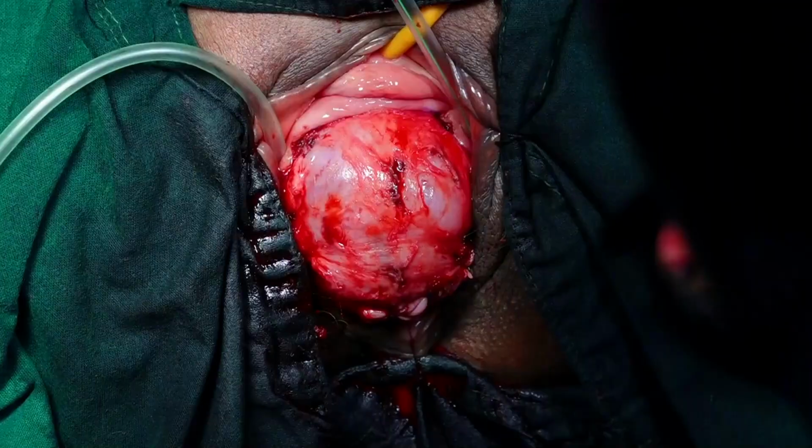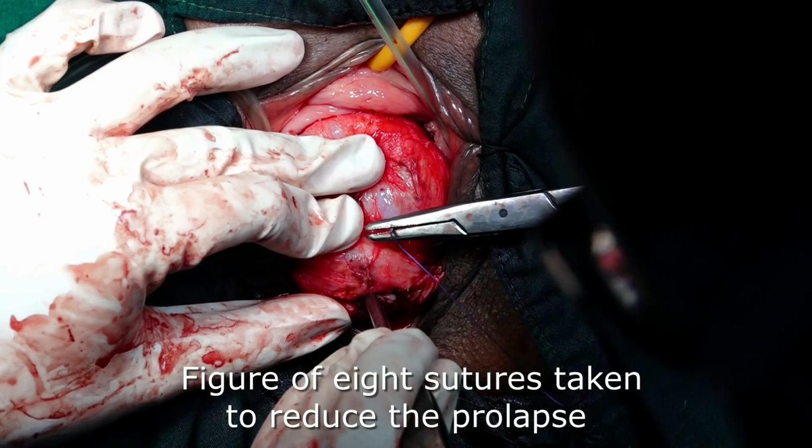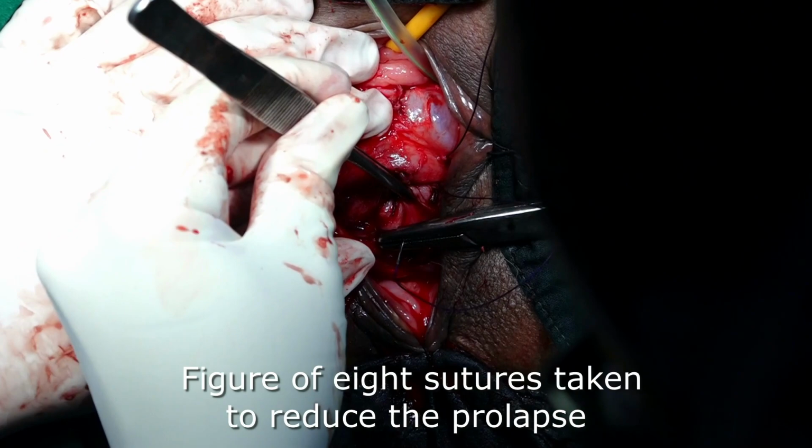With the tunnel created on both sides, the surgery proceeds to reduce the prolapse with multiple successive figure of 8 sutures.